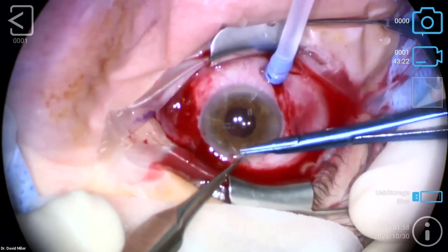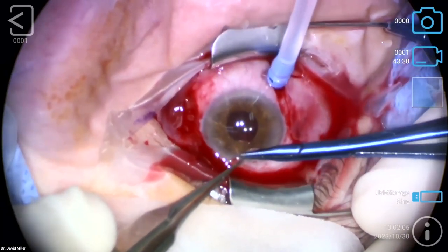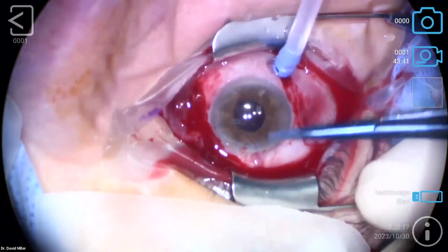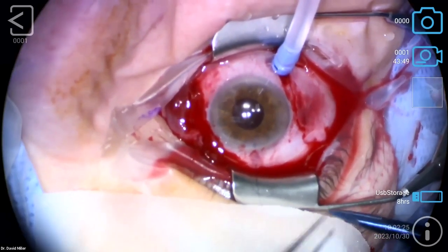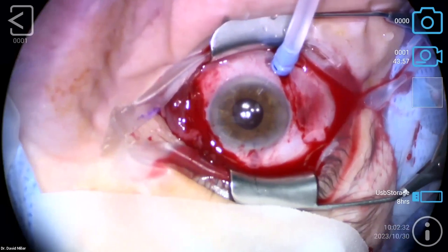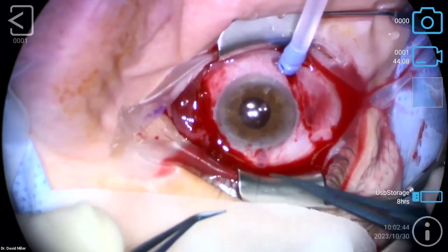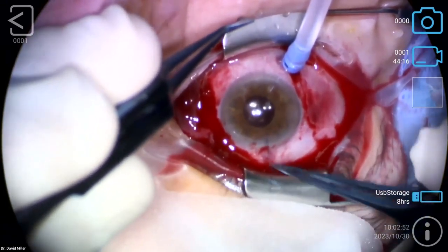And this time what we're going to do, by the way, is we're going to also, nice bite there, clamp the infusion so I'm not tying against the intraocular pressure of the vitrectomy system. There you go. I'm going to cut this down here again. So sometimes if you're having trouble suturing, especially 10-0 sutures, in a retinal surgery, you have to remember that the big difference is we're pressurizing the eye and you're tying against that, a little tougher to keep the suture tight while you're putting it down. So just turn it off so the eye can soften a little bit, or just be better at suturing than I am, which is quite possible.